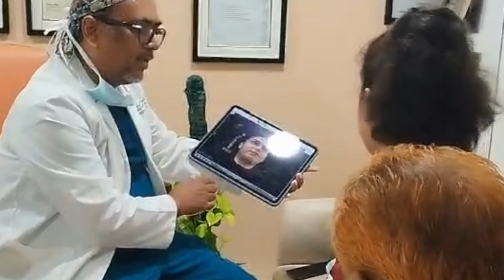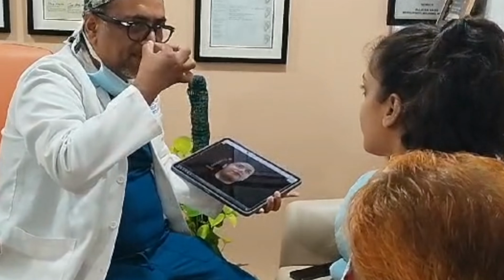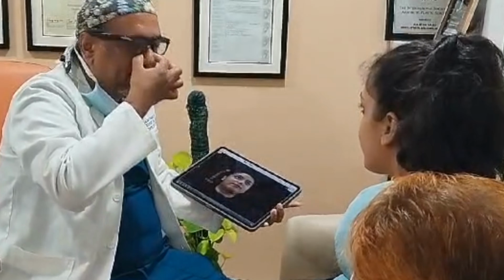Hi, in today's video we're going to be talking about the Crisalix morphing software, which is so useful for us plastic surgeons. I'll tell you how this software is so useful. It essentially takes in the pictures of the patients, and you can do volume rendering, additions, and change some parts of the body. What you're planning to do can be shown to the patient in real time, and then the patient accepts whether she or he likes that particular change, and once that change is done, we can get into an agreement with the patients.